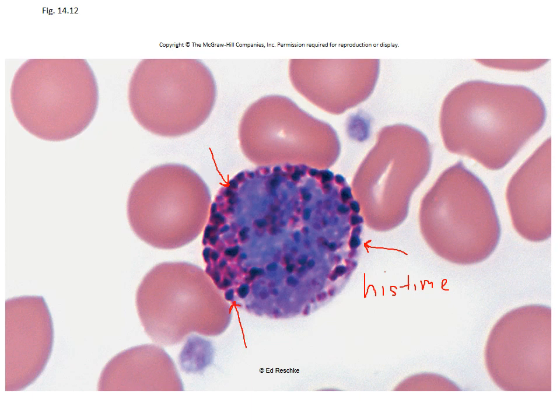The average person on the street would call heparin a blood thinner. That's not necessarily a great word if you're in the science field. It's really called an anticoagulant. It stops blood from clotting abnormally.